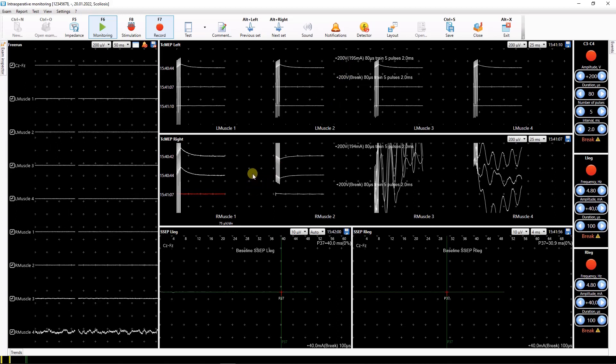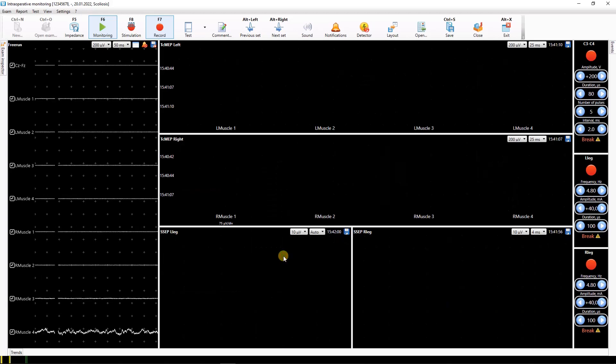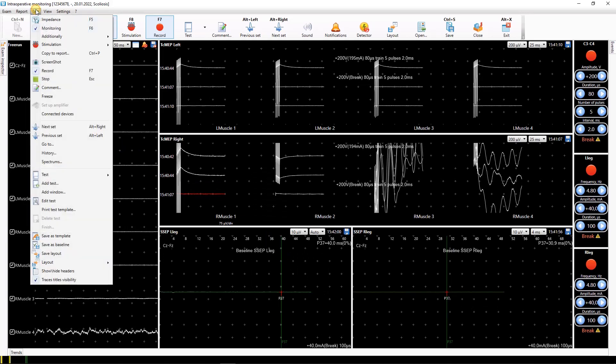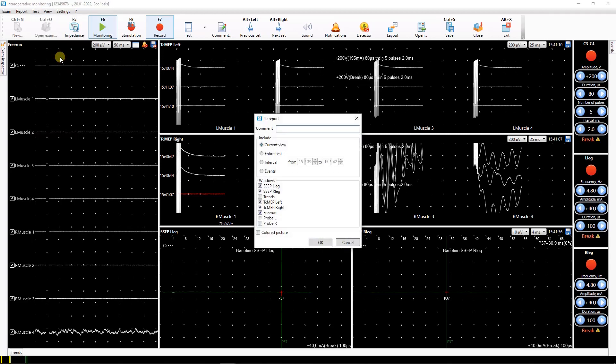Traces from the data window can be easily copied to the report. To do that, use copy to the report context menu command. You can also copy the entire contents of the test window to the report using test copy to the report command.